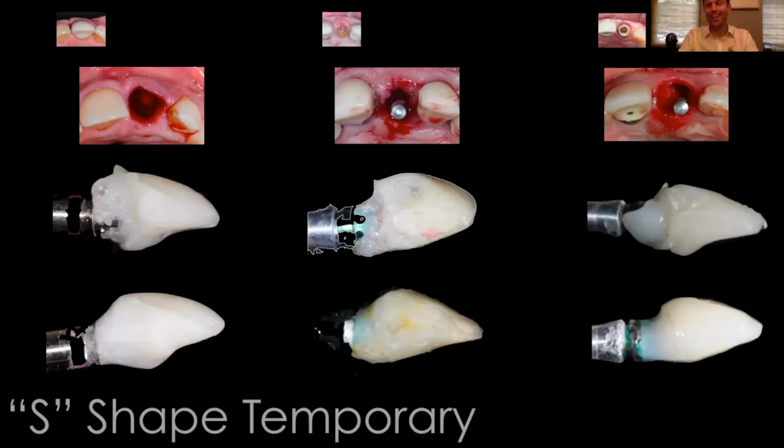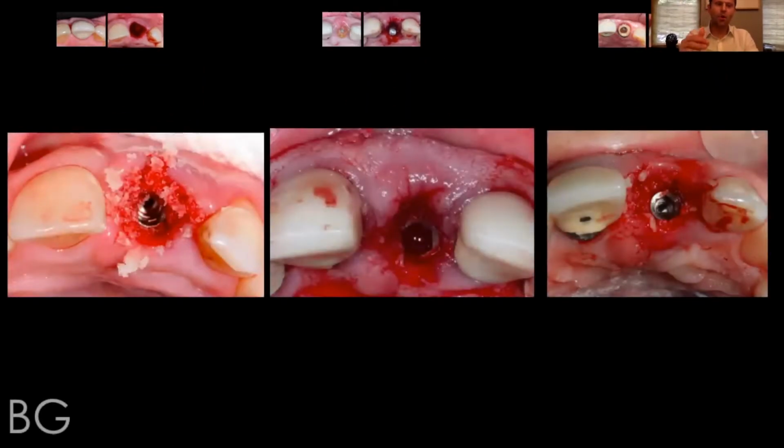Once you finish designing the temporary, you can move on to the next thing, and that's filling the bone into the gap. So then you pack the bone in. What material you use, I like corticocancellous bone graft. And then I'm able to just pack that bone in there, remove the healing abutment or cover screw, whatever you have on during that time, because you don't want any of the bone to get into the implant. So you have something covering that area at the time.